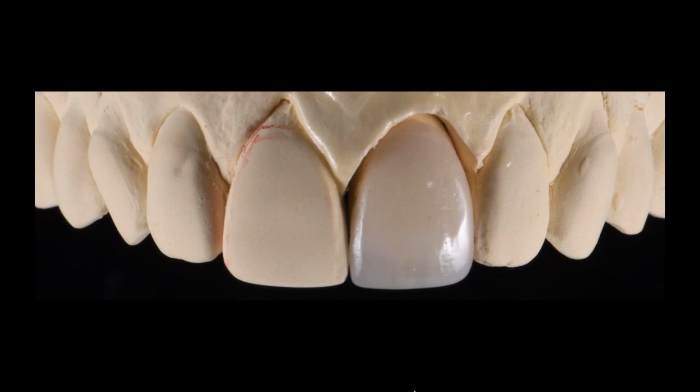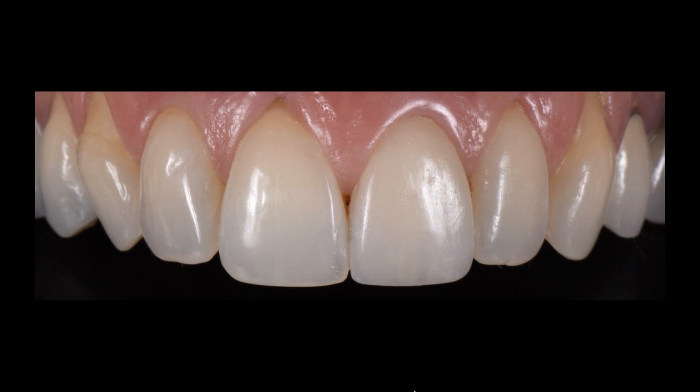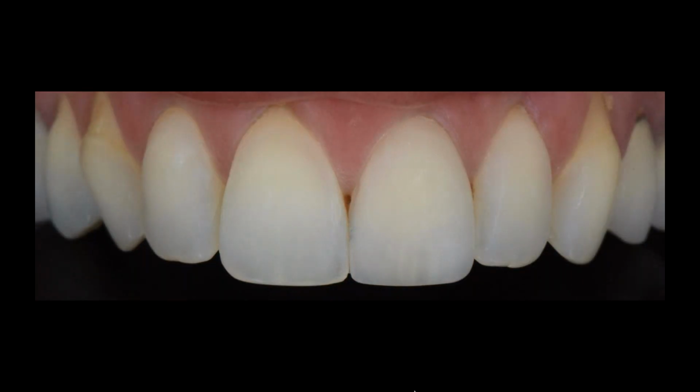I fabricated this with VM9 a few years back. Here it is on the try-in. I'd say the value looks a little on the lower side to me at this moment. I think the patient was fairly happy with it, and we just let it go at that point. Could I have improved it? 100%. I always feel like you can, but the goal is that if the patient's happy and we're really close, how much we overanalyze goes back to that face, white, pink concept. Really, what I care about is that I get the basics right. And what are the basics? Look at my polarized photographs. The value could have been up a hair over here.